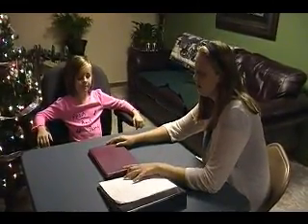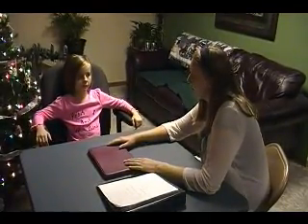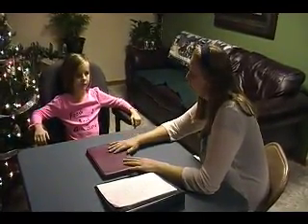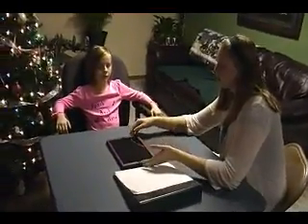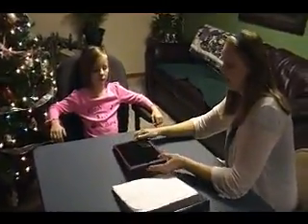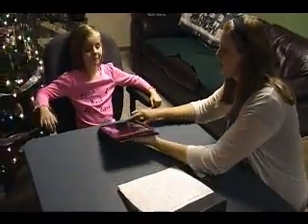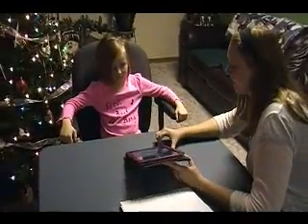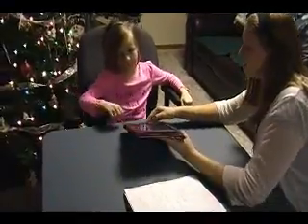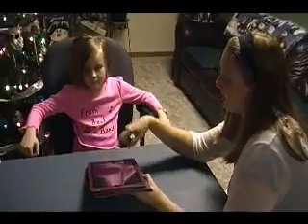Alright, so what you need to do when you first buy one is to charge it up, and then you can download some apps. I have 2 or 3 communication boards that I'm going to work with you on today. So once it's all charged up, if you have a case, you'll just open it up, and then you see this button right here? That's what you're going to press to turn it on. So you want to press that button for me? Good job. Alright, now we're going to go into this app right here. Want to press that one for me again? Great job.